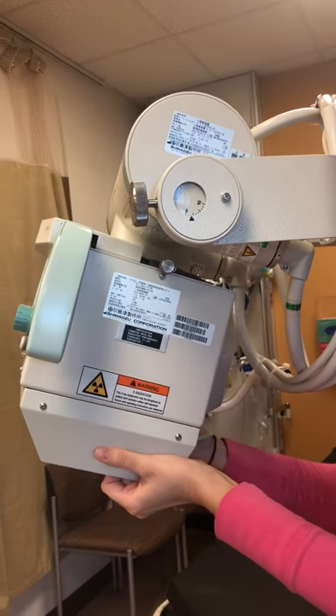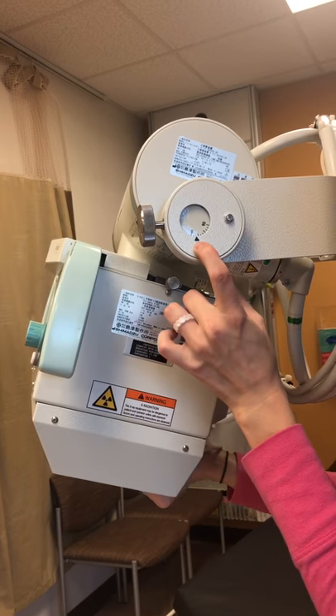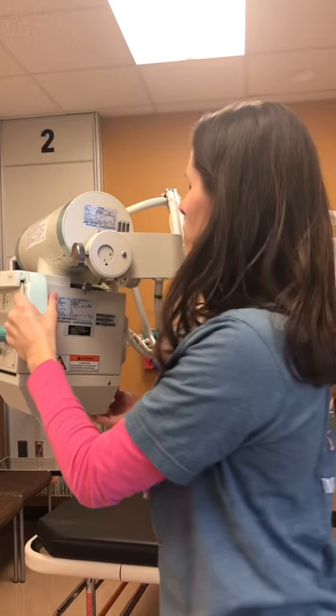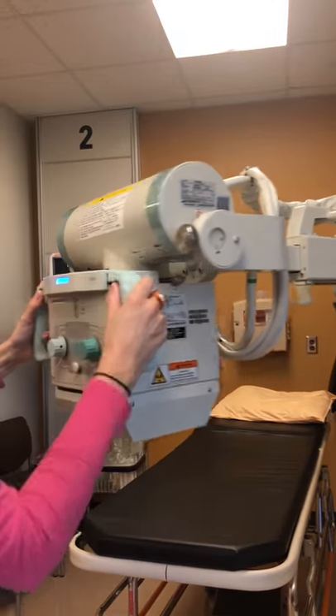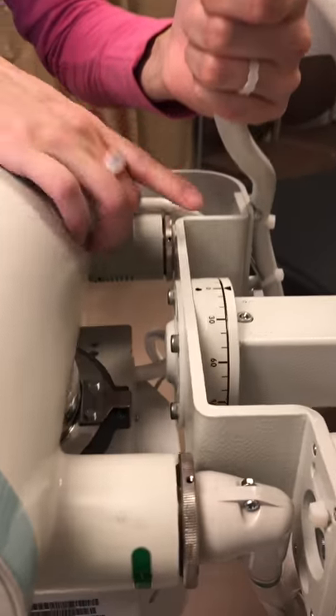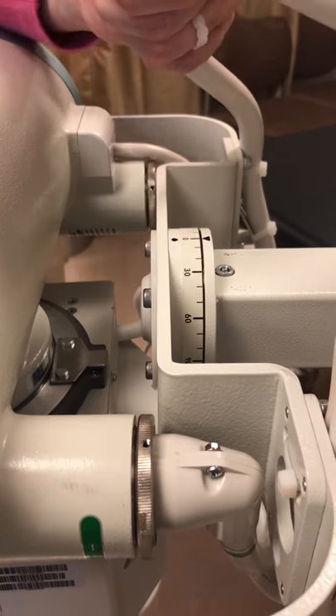You can see that you're changing your angle there. There's also another set of angulation meters — we reviewed it in our knee X-ray videos — right here.